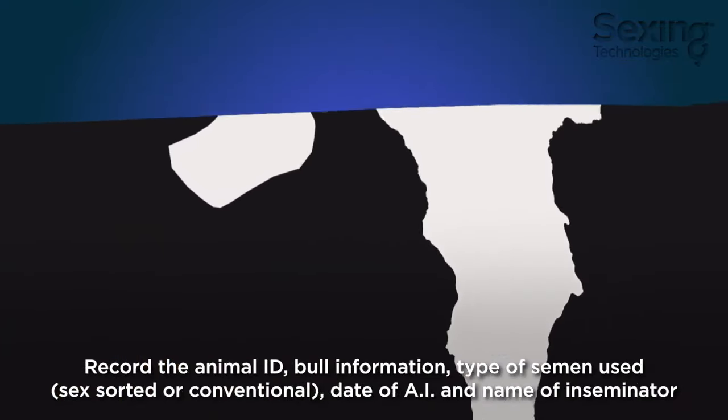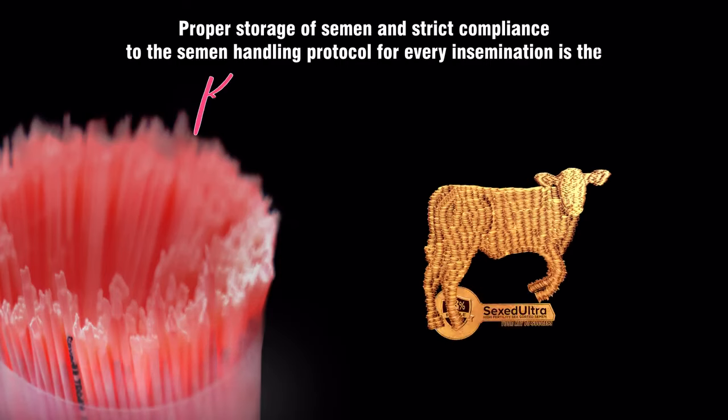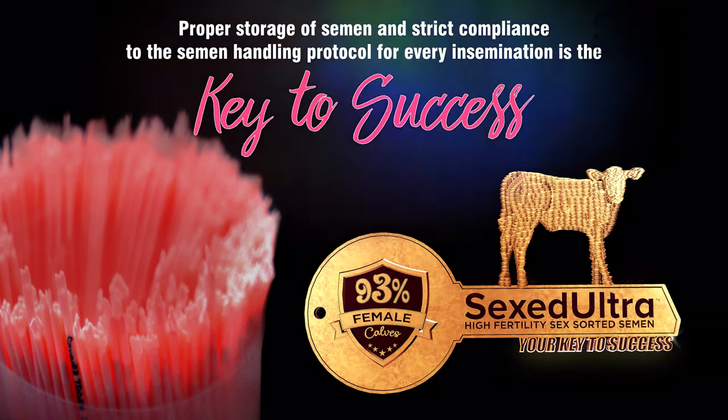Record the animal ID, bull information, type of semen used such as sex-sorted or conventional semen, date of AI, and the name of the inseminator. The keys to AI success are proper semen storage and strict compliance with the semen handling protocol.